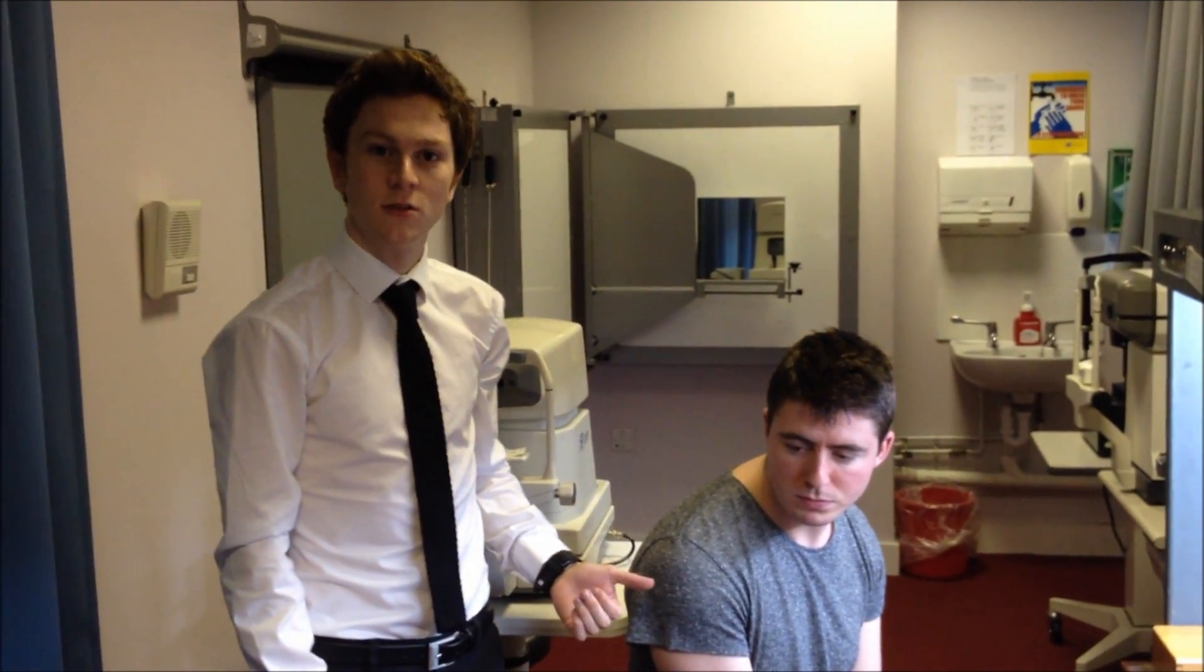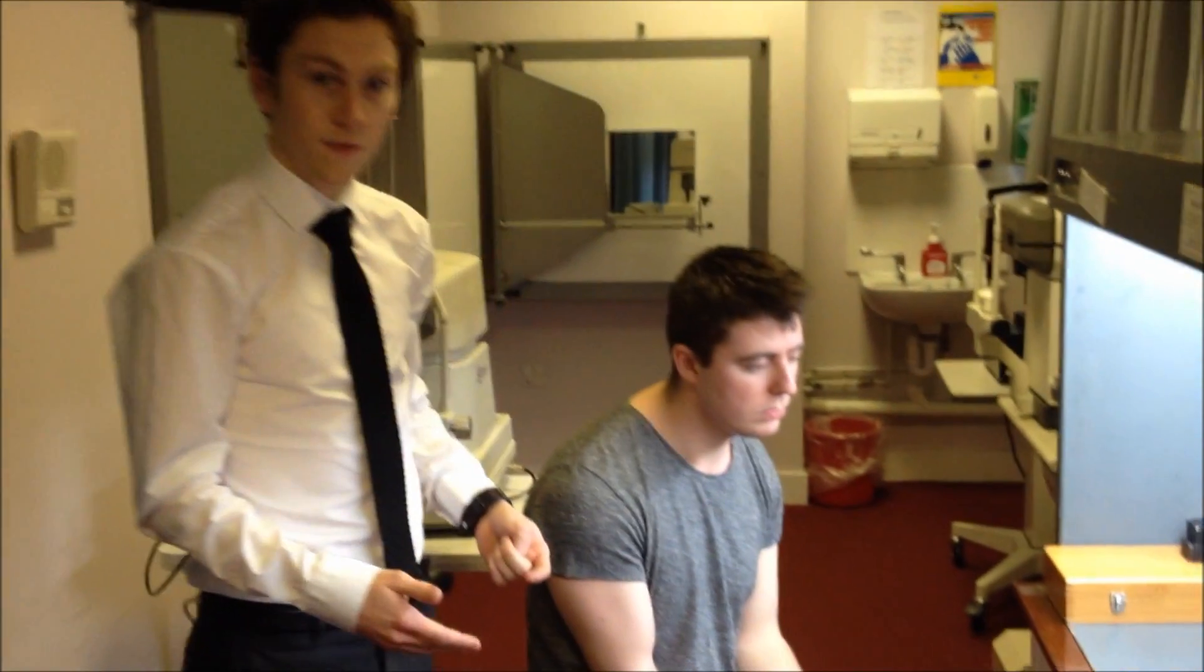This is Thomas. Thomas is our patient today and he's here to have his color vision assessed. So we're going to do the Farnsworth D15 test.